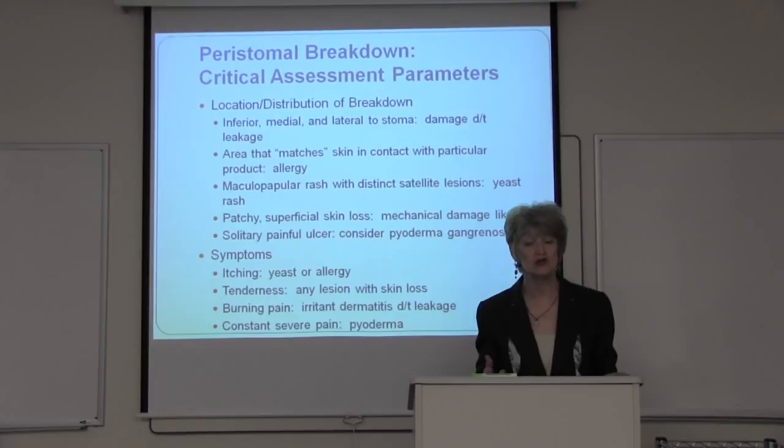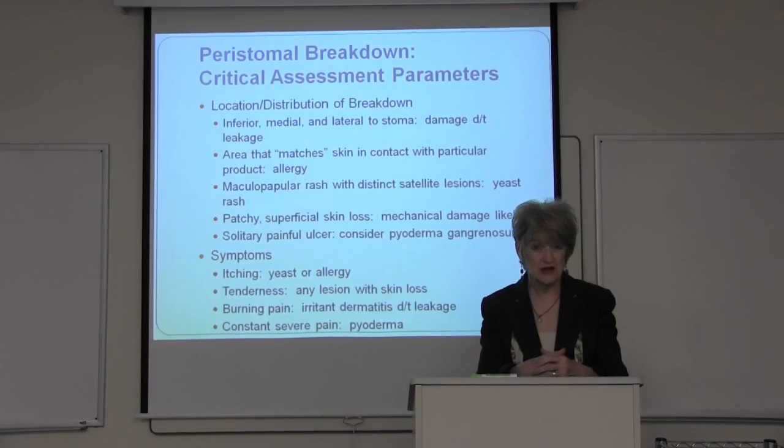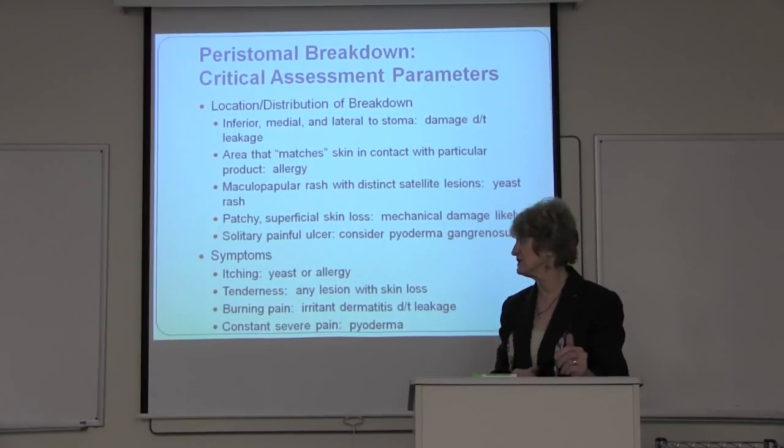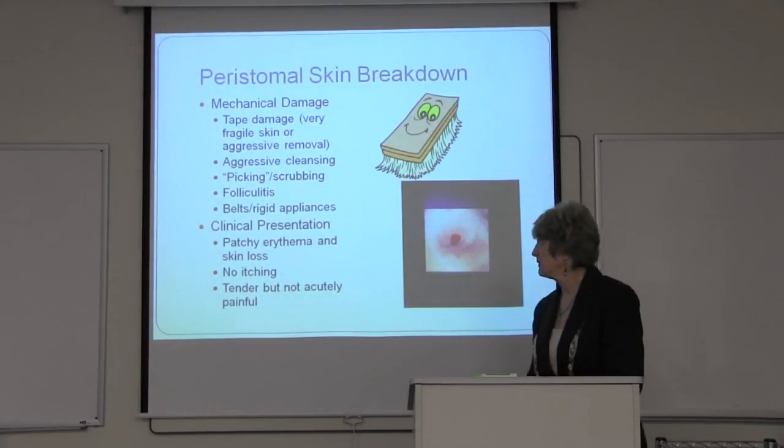If a patient tells you, after I get my new pouch on and my skin's all covered, I feel pretty good, but then within a couple of days, anytime anything comes out of my stoma, I have that burning pain. That burning pain occurs when the drainage contacts that damaged skin. It tells the patient you need to change your pouch immediately. It tells you that this is probably an irritant contact dermatitis. And if it's constant severe pain, it's almost always pyoderma.